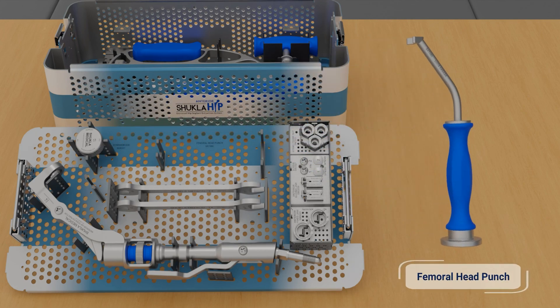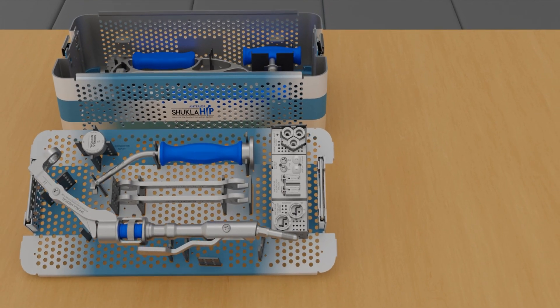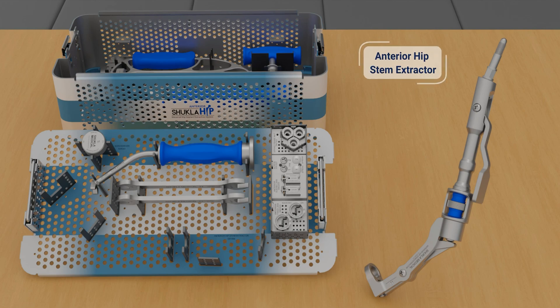The femoral head punch quickly removes the femoral head component of the hip stem. The anterior hip stem extractor attaches to the trunnion of the hip stem in line with the implant itself, allowing for reduced risk of fracture and maximum application of extraction force.